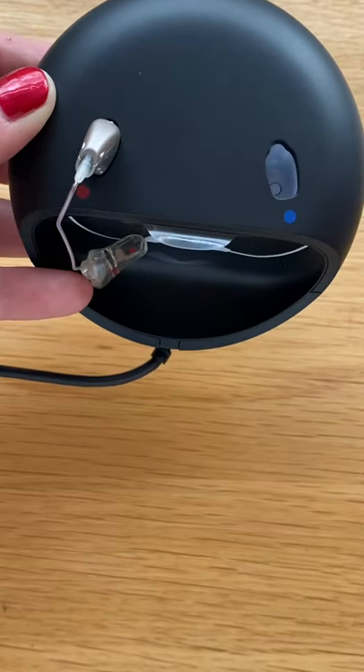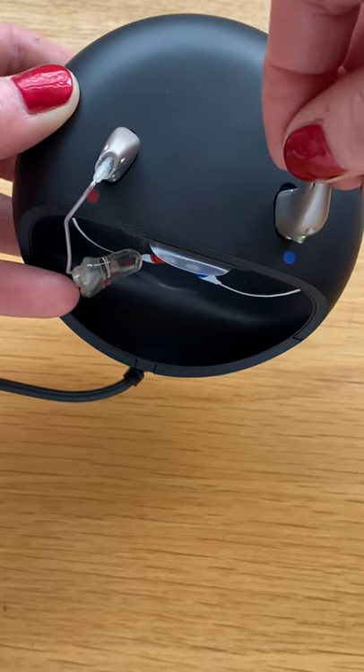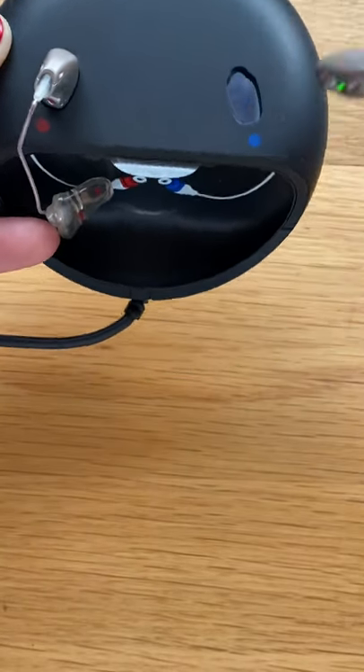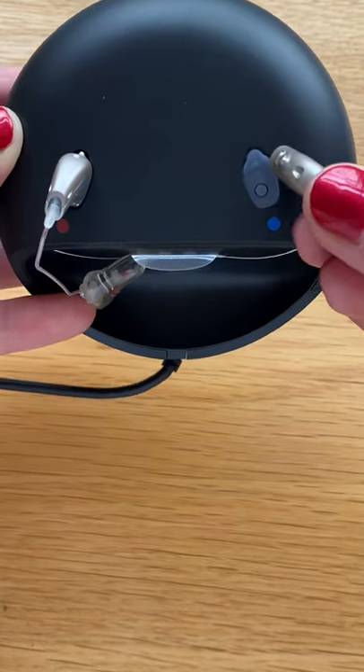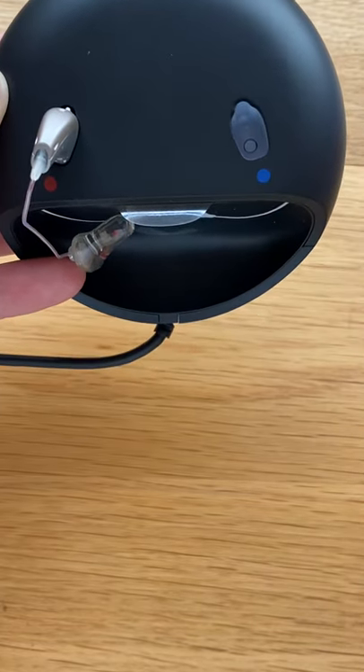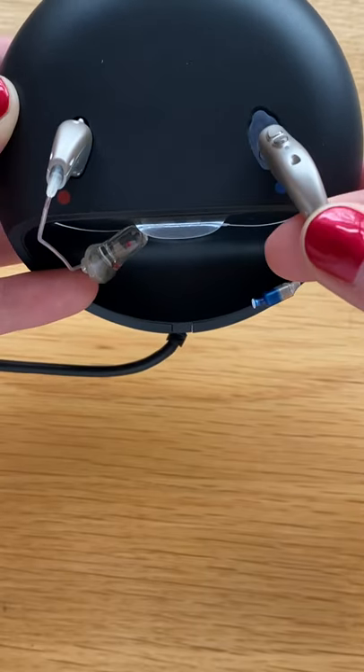If we accidentally try and push them in back to front, this may damage the instrument. There is a small recess at the back of the charging portal to accommodate the battery buttons on the back of the instrument.